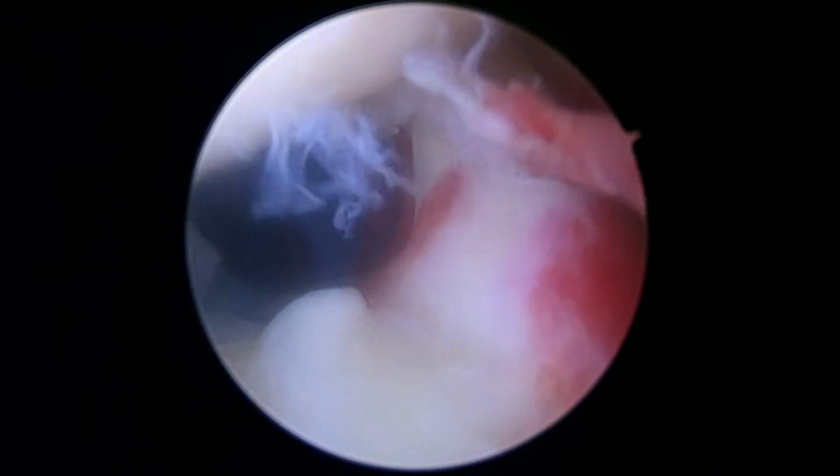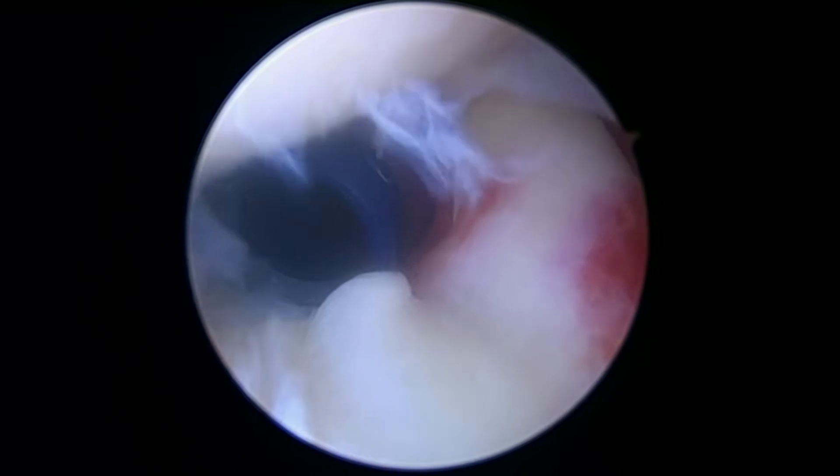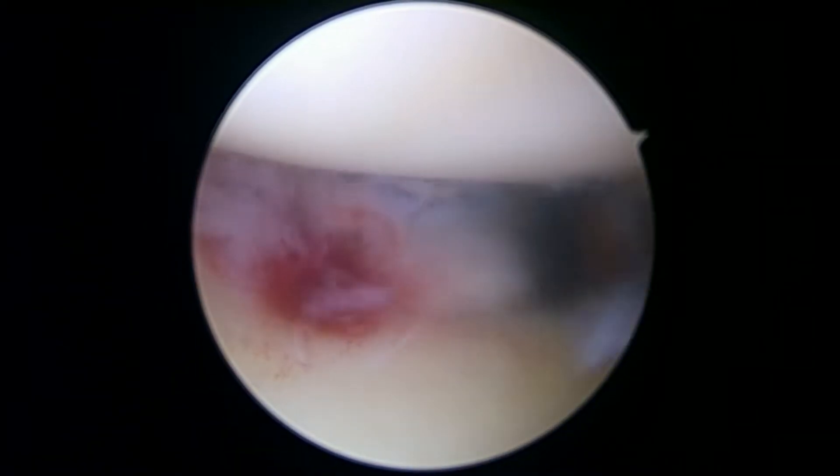Okay, hi, it's Dr. Bueffer. We're just getting started on your left shoulder here. First thing we want to do is confirm that you've indeed got the SLAP lesion that we thought you had, and you do.